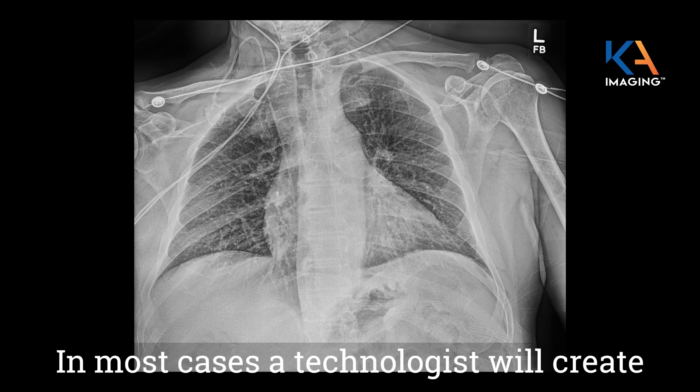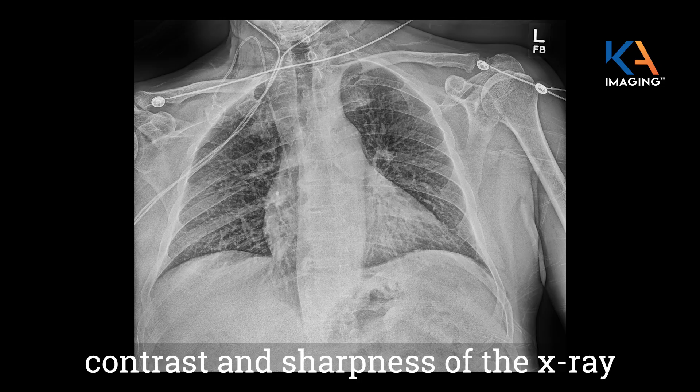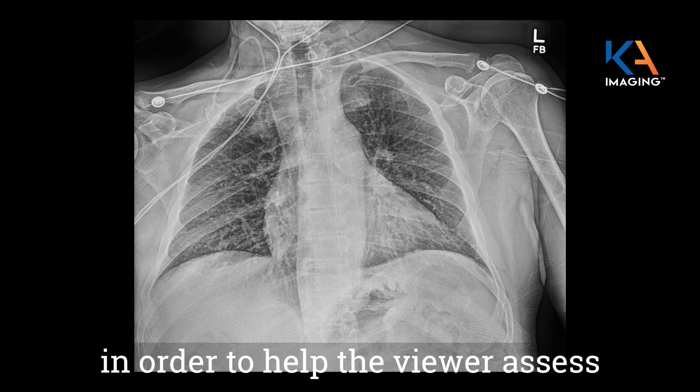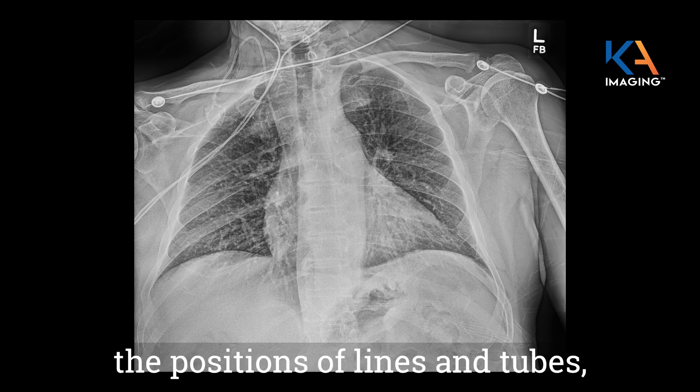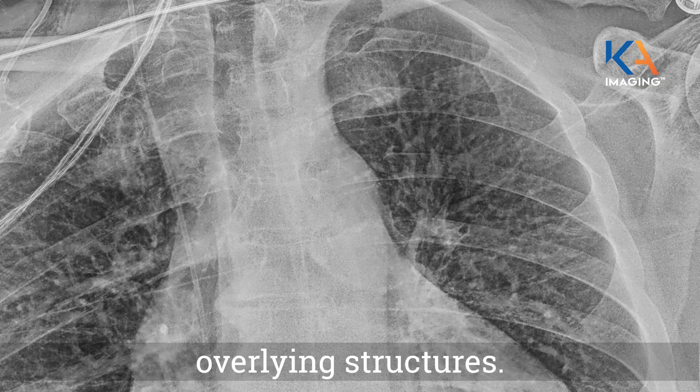In most cases, a technologist will create a companion image that changes the contrast and sharpness of the x-ray in order to help the viewer assess the positions of lines and tubes. But this does not remove overlying structures.